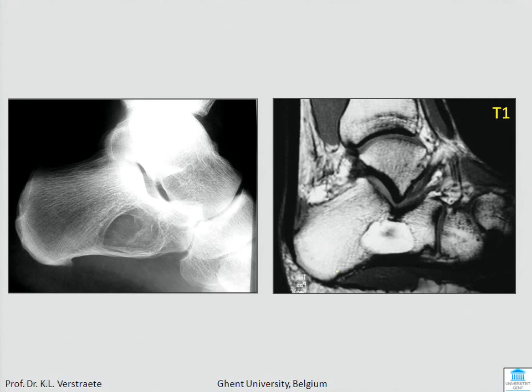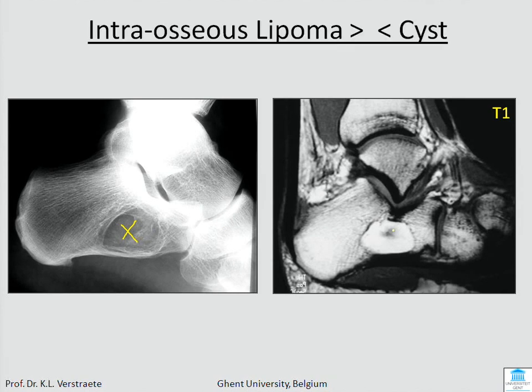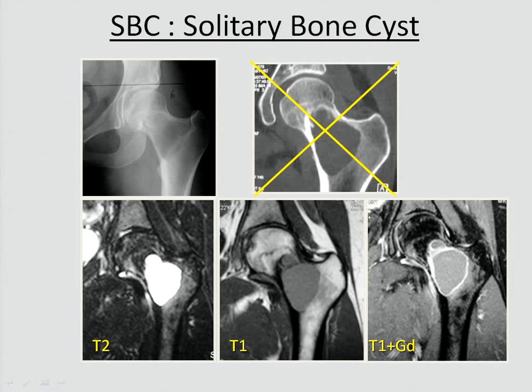So we have seen bone tumors, cartilaginous tumors, and fibrous tumors — now we go to all the rest. This one is a lytic lesion in the calcaneus, and on T1 it's white — so when it's white on T1 you know it's an intraosseous lipoma. If it were dark on T1 and white on T2, it would be a cyst. Another type is the solitary bone cyst — a lytic lesion where you do MRI: it's white on T2, dark on T1, and after gadolinium you see enhancement of the wall.